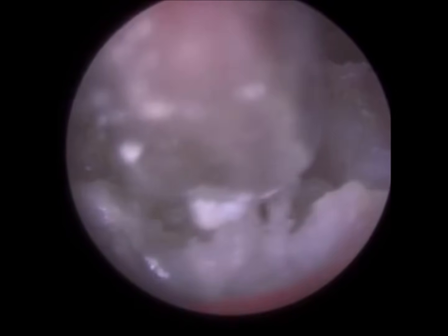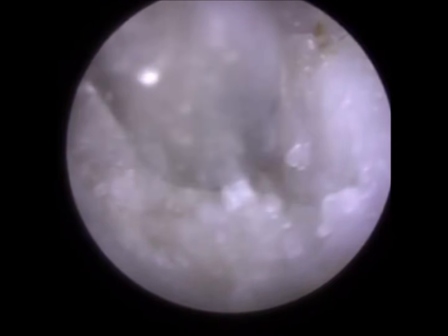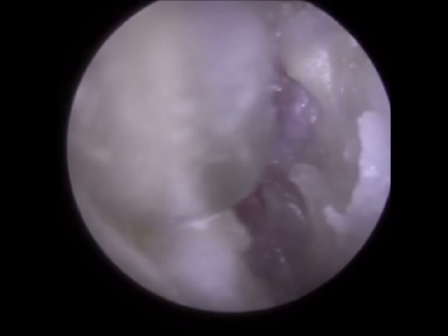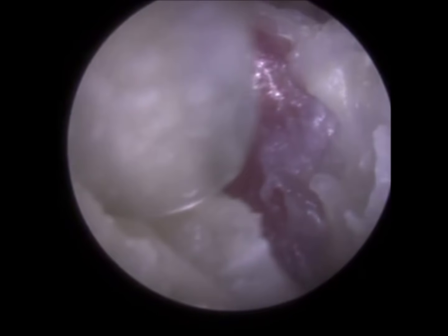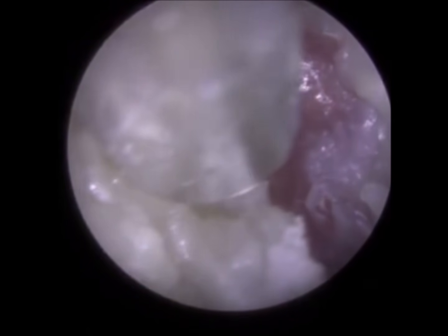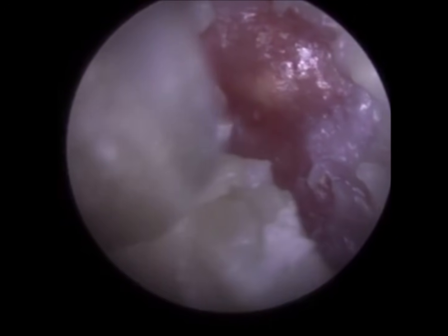It's a bit odd, whilst I'm narrating it, I'm almost standing up trying to look over into this crater myself. I think I was actually standing up during the procedure here, so I can really angle the endoscope downwards to get the best view possible. So you can see now, you're seeing more and more flesh. This part of the ear canal was not originally there. It has arisen due to patients' infected ears. So there's dead keratin. This keratin gets infected and it starts eroding the structure, the cartilage portion, and the bony part of the ear canal.